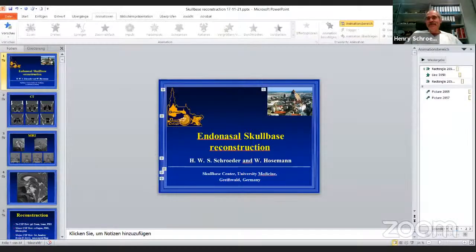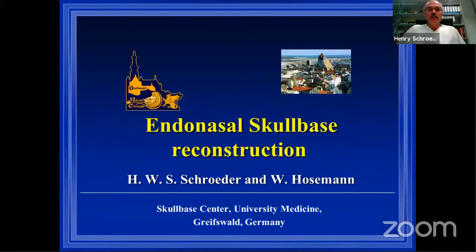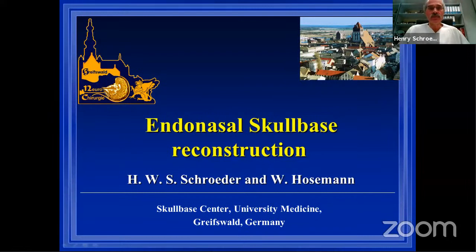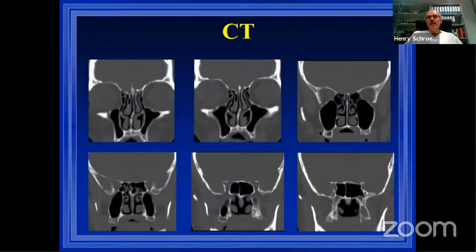Thank you. Dear Michael, thanks again for the invitation to this webinar series. So my task is the endonasal skull-base reconstruction. Of course, before you start with the surgery, we have to keep in mind how we close a defect. And this is especially important in endoscopic endonasal skull-base surgery because of the risk of CSF leakage.